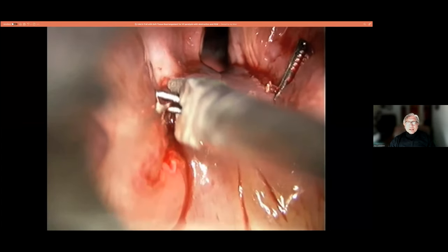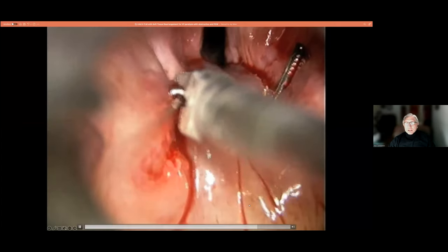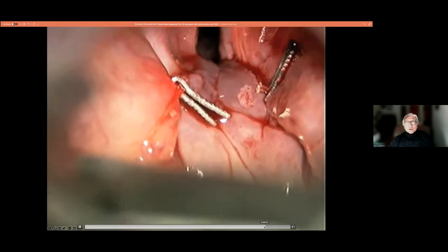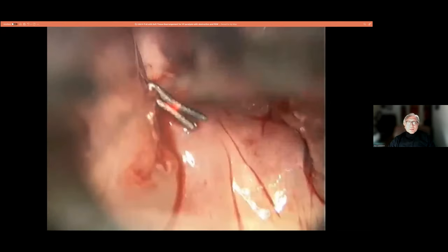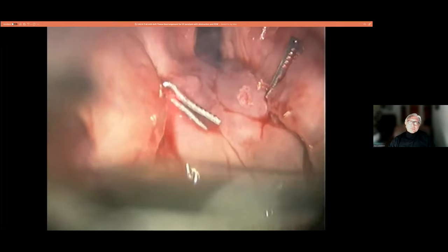So that said, if a clip is loose, you can simply squeeze it and again, to cut the suture material, you'll see the laser is an excellent option. You can lay it against tissue, it doesn't matter. You can hold it in air. You can pretend you're in a shooting range and you're aiming for a target.